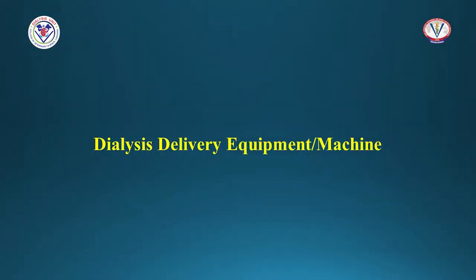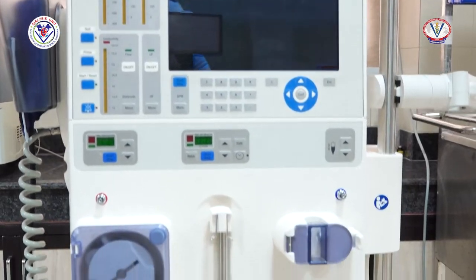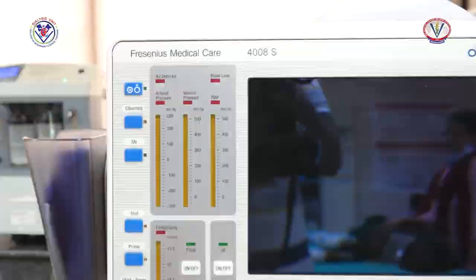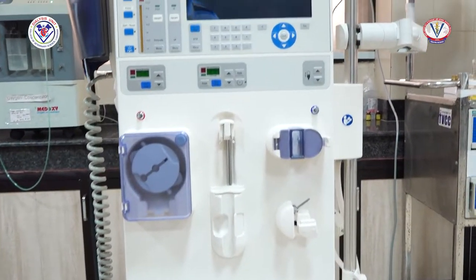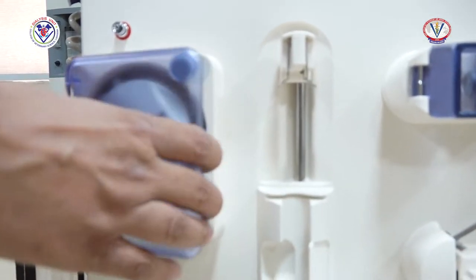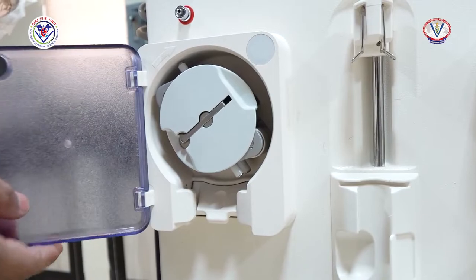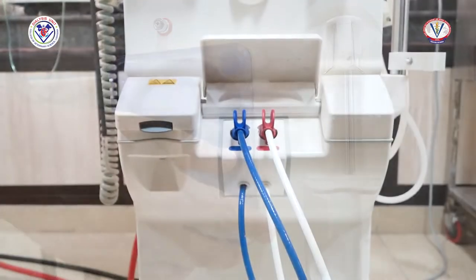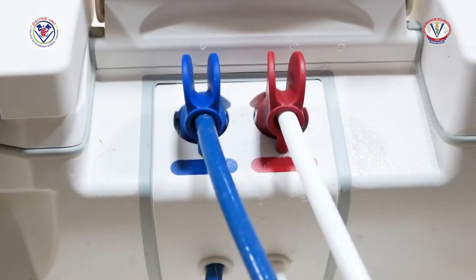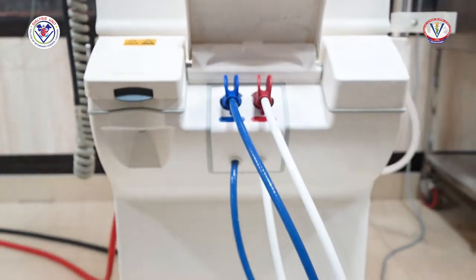Dialysis delivery equipment and machinery. We have a dialysis delivery machine named Fresenius 4008S, which is an intermittent hemodialysis machine. Here, we have a blood pump, which is used to take out blood from the patient's body through blood tubing. There are two tubings, blue and red, where blue is for bicarbonate solution, or part B, and red is for acidic solution, or part A.